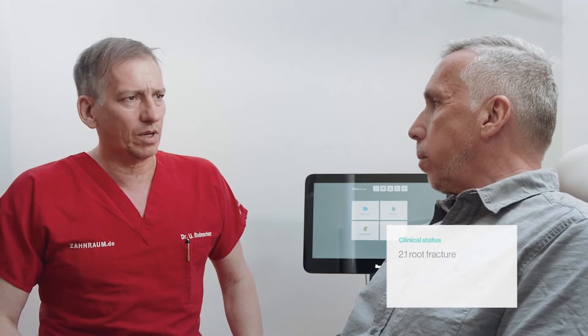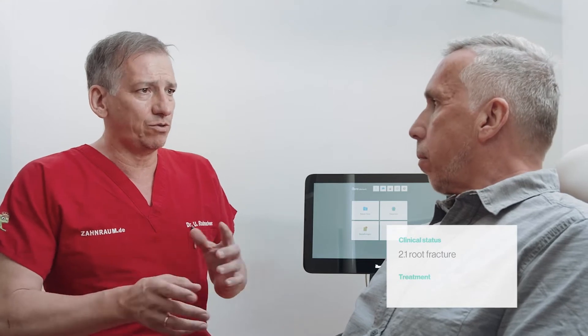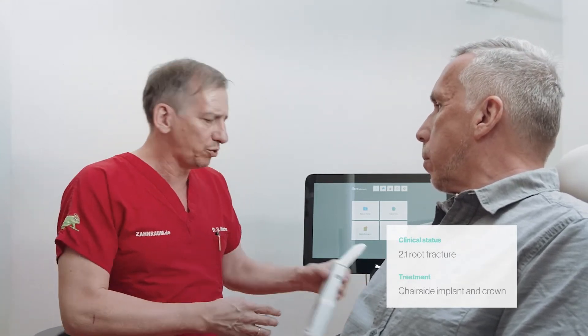This patient came to see Dr. Radmacher because he noticed inflammation around his upper left central incisor. The diagnosis was a root fracture, and the chosen treatment approach was extraction followed by implant and crown placement.